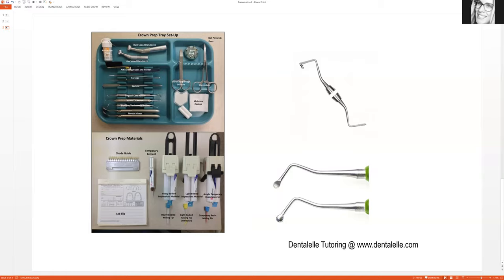The dentist takes a couple of minutes to carefully pack the retraction cord all the way around the tooth so the gum tissue is being pulled away from the tooth — this makes for a much better final impression. Once satisfied, they need to make sure the gum is not bleeding at all, because bleeding will prevent a good final impression. That is why the cord is often placed in a hemostatic solution.